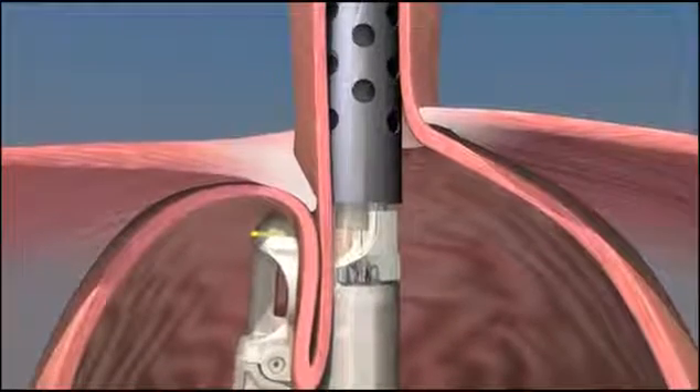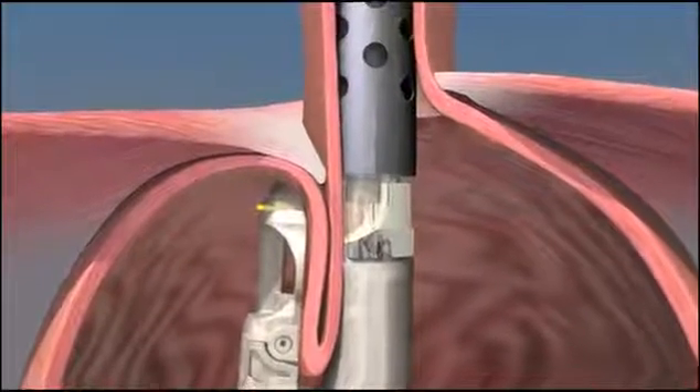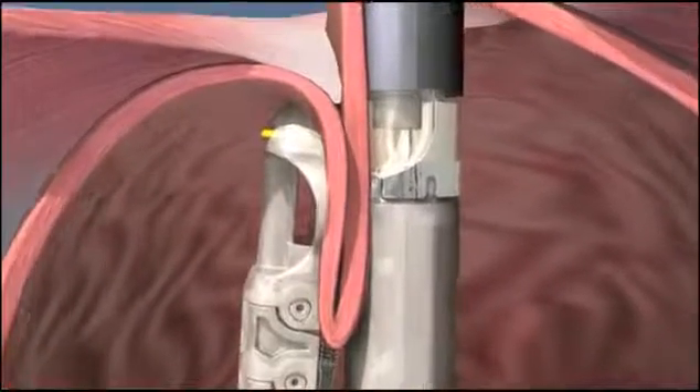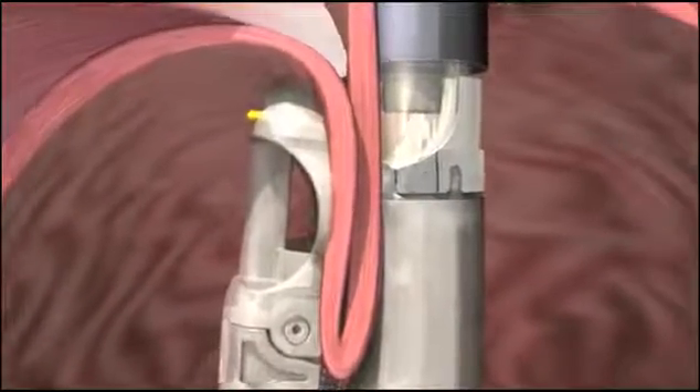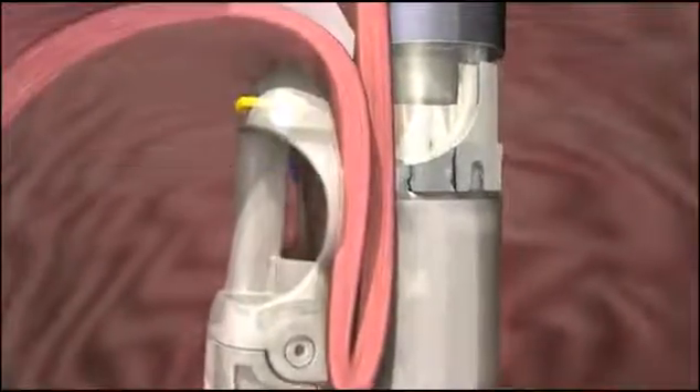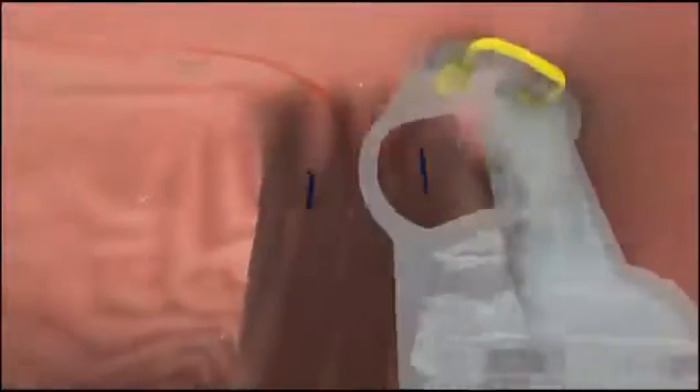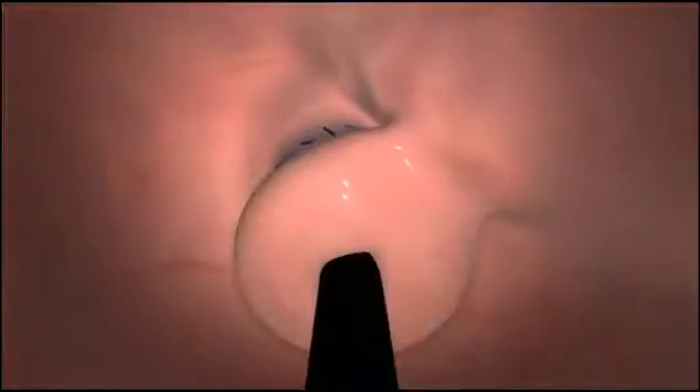The EsophyX device is then rotated, wrapping the fundus toward the lesser curvature of the stomach. Under visual control, the EsophyX device is then used to deploy two H-shaped fasteners to hold the fold of tissue in place and maintain the wrap. The wrap is then tightened further and the next pair of fasteners are placed one centimeter above the Z-line. This procedure is repeated on the opposing side.